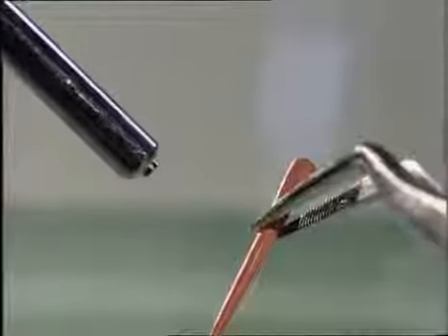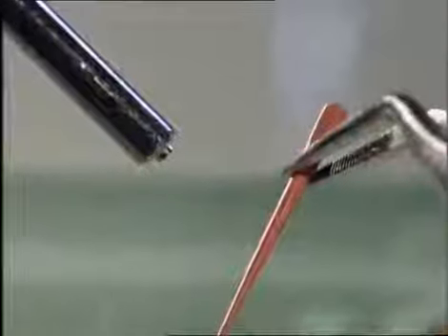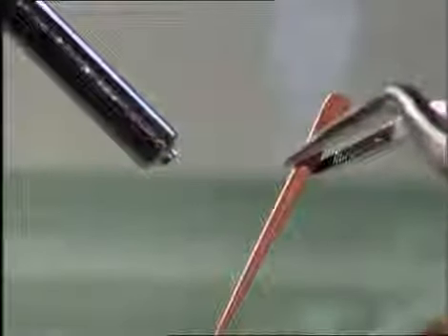The master cones are sterilized in sodium hypochlorite, rinsed in alcohol, and dried with the air-only syringe. Remnants of sodium hypochlorite get eliminated and the cone becomes stiffer. The pre-fitted master cone is slightly buttered with sealer. The sealer should be mixed somewhat thicker than the manufacturer's recommendation. Before the cone is inserted in its final position without pressure, the carefully rinsed and dried canals are covered with a very thin layer of sealer.